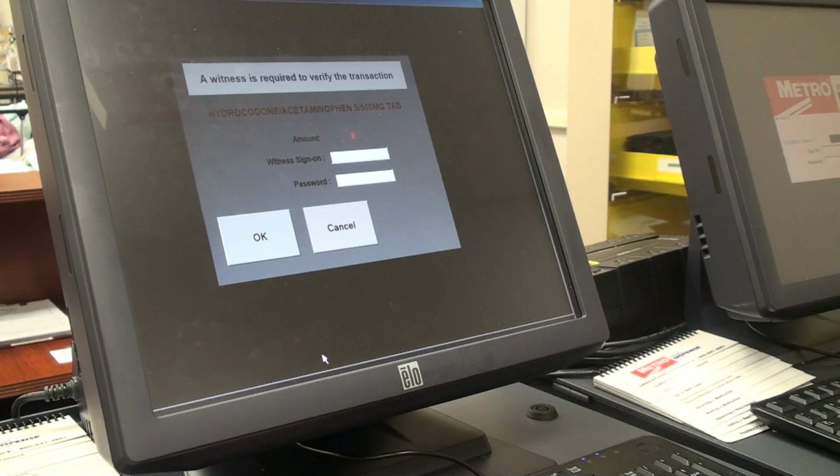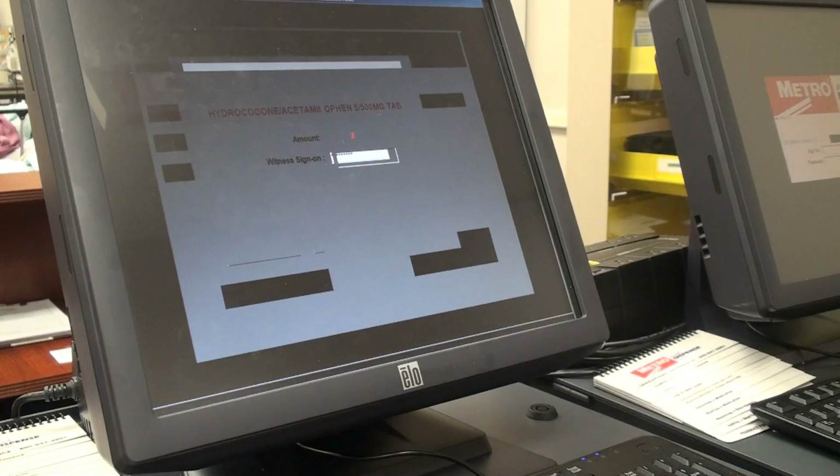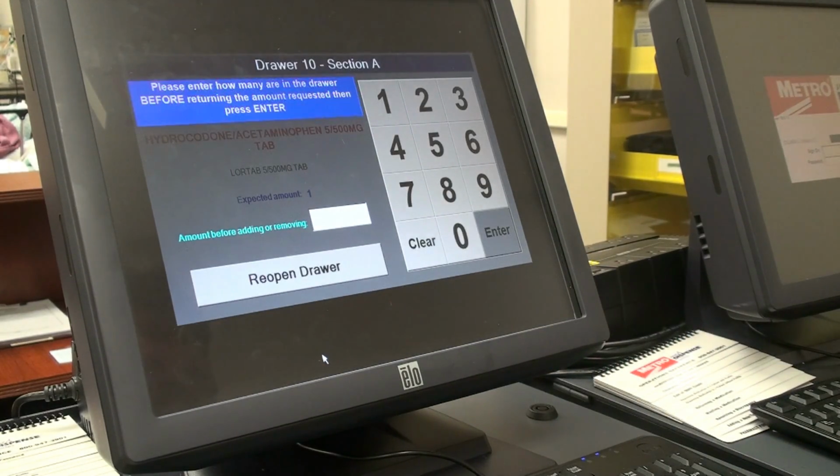So I will use a different username. As students, your partner can help you out with this one to return medications, and it gives both of you an opportunity to experience the med dispenser. You hold the drawer open back up.